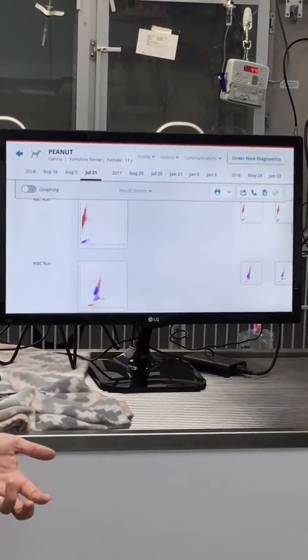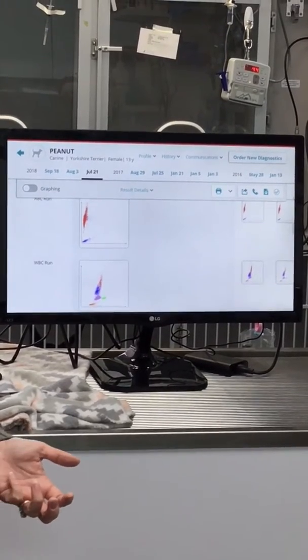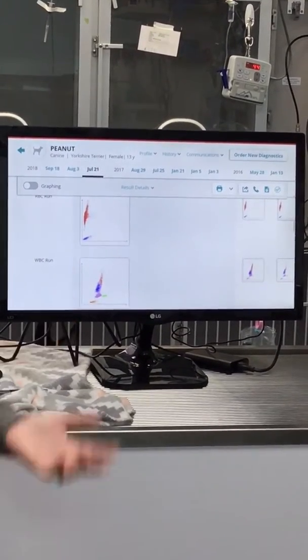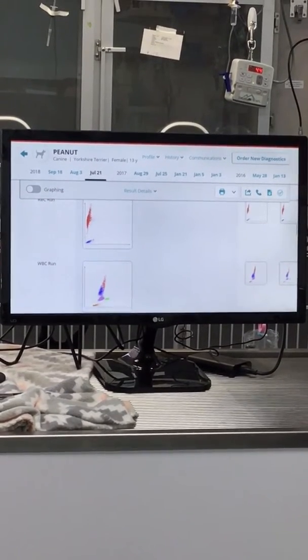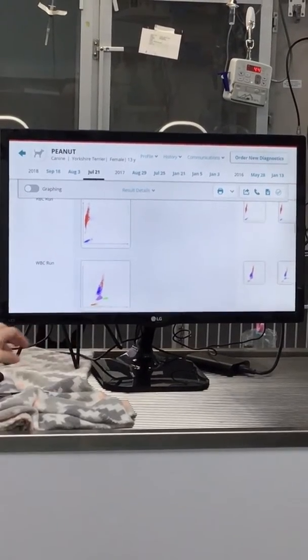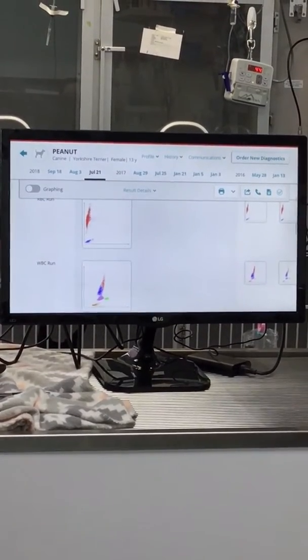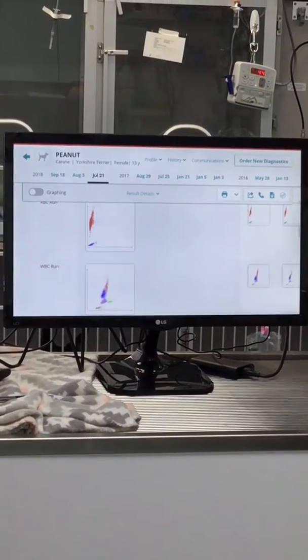So they pulled another sample, we looked at a smear together, and it definitely had very reactive lymphocytes. Then they sent that in to Idexx for a pathological review, and it came back that that's what it was. So we're getting it typed right now. Just by looking at that, you can see those trends. If that's something y'all are interested in, I'm happy to come back in and do a full staff training on dot plots, because I think they're super cool.